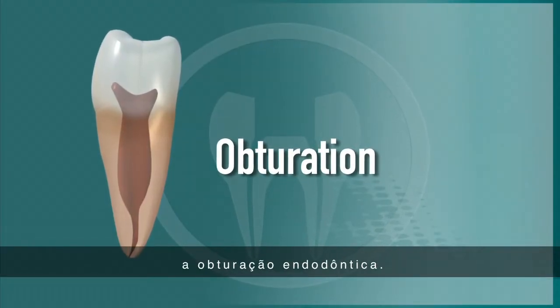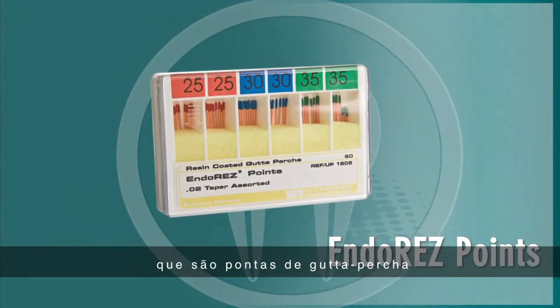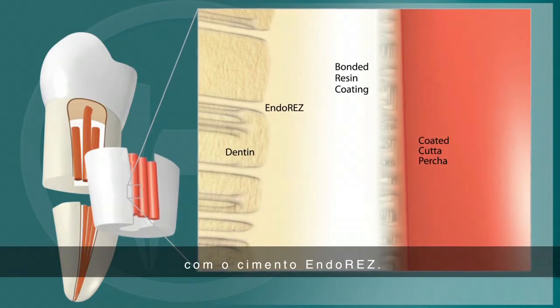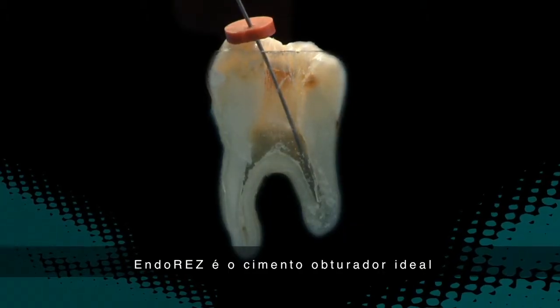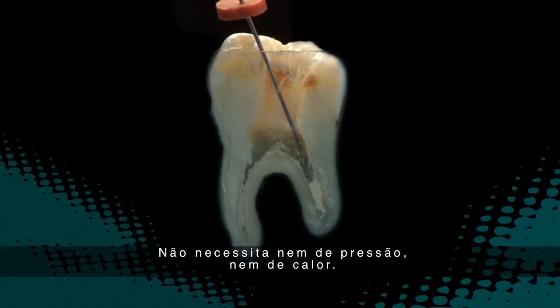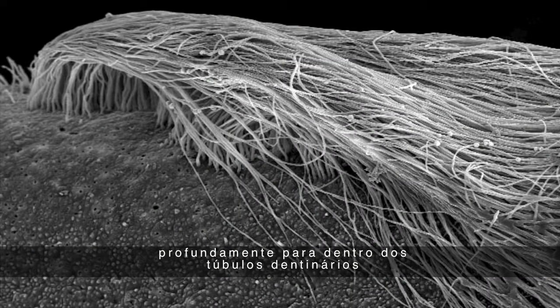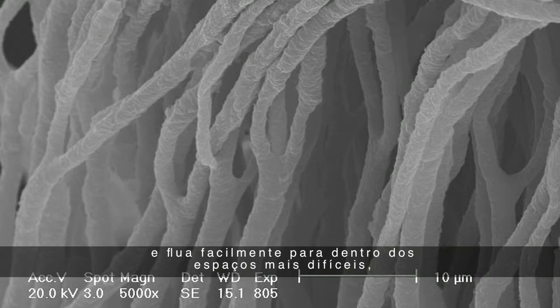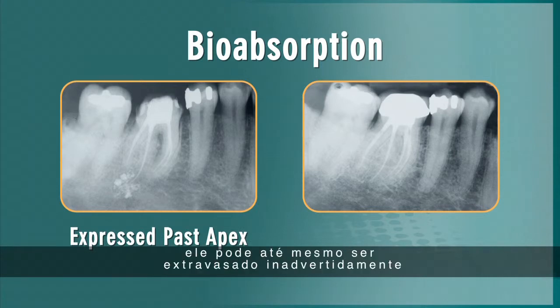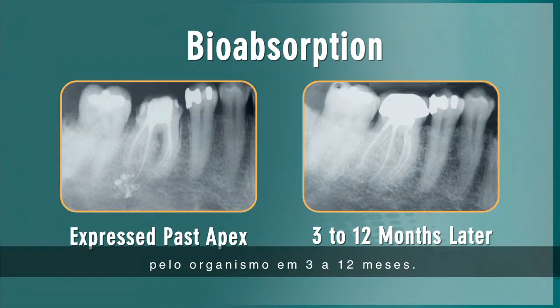We are now ready to move on to the obturation portion of the procedure. The EndoREZ system includes EndoREZ points, which are gutta percha points with a unique resin coating that allows them to bond covalently to the EndoREZ sealer. EndoREZ is the ideal canal sealer when apically delivered via a 29-gauge Navi tip, eliminating gaps and voids. No pressure or heat is required. The sealer's hydrophilic feature allows it to follow residual moisture deep into the dentinal tubules and readily flow into intricate canal spaces and auxiliary canals. Because EndoREZ is completely biocompatible, any sealer inadvertently expressed beyond the apex will be metabolized by the body in 3 to 12 months.